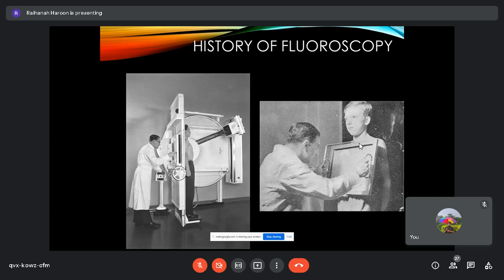For example, if we want to position the patient, or if you want to image the uterus in a hysterosalpingogram, the uterus is inside, at the center. We want to adjust the position and so on. We use screening. When we screen, we give a pulse, like a pump, depending on the setting. If you put, like, 4 pulses per second, it will give off 4 pulses very fast.